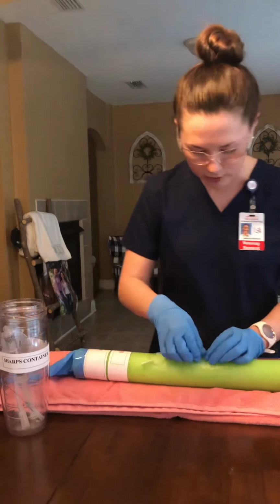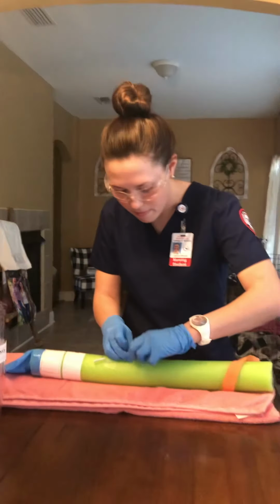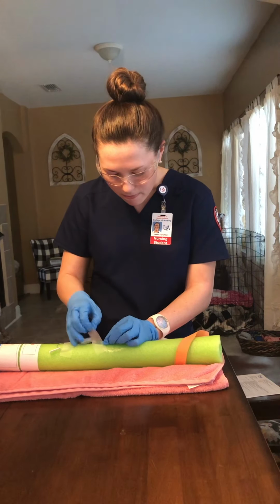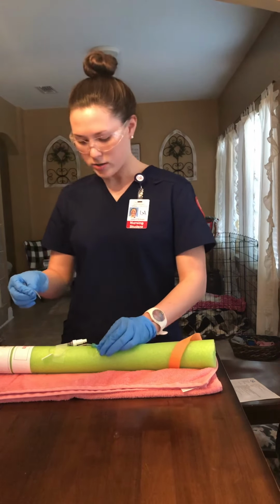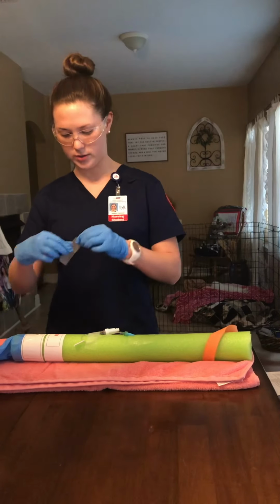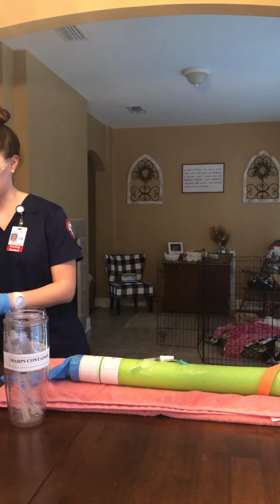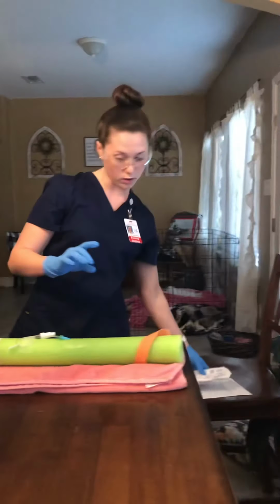Once that's done, I'm going to remove the temporary tape. Okay, so once that is done, I'm now going to gather my equipment and dispose of it. This I'm going to be using for another part of the procedure, is the sterile gauze.